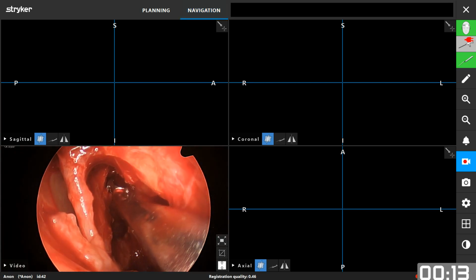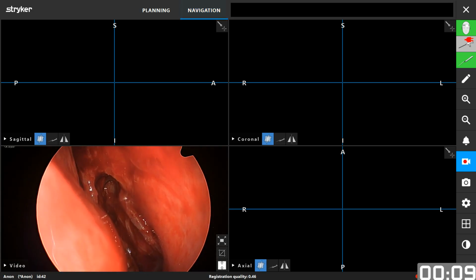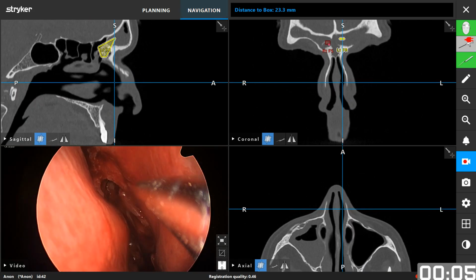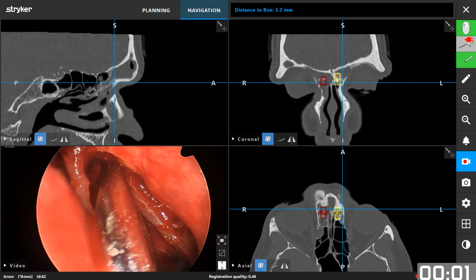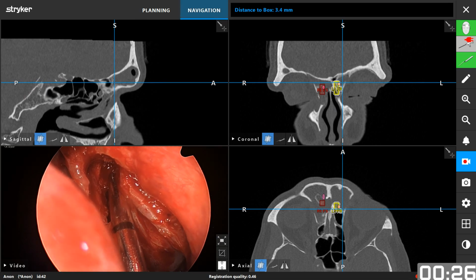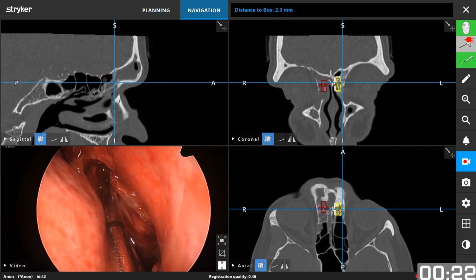Just widening the axis again. The next question is whether we need to get down the partition or not.